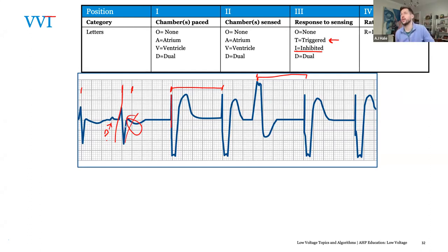A couple of reasons you may do this: if they have a bi-V and a lot of ectopy, but we're not atrially tracking, say they have bi-V with AFib with RVR or lots of PVCs. One argument you could make is that by having some electrical contribution to the intrinsic complex, you're getting a little more efficient pump and a little more electrical efficiency. Whenever we're programming a bi-V, we're trying to get the most narrow QRS possible, and there's some degree of QRS narrowing when you pace into a complex. So that is one advantage.